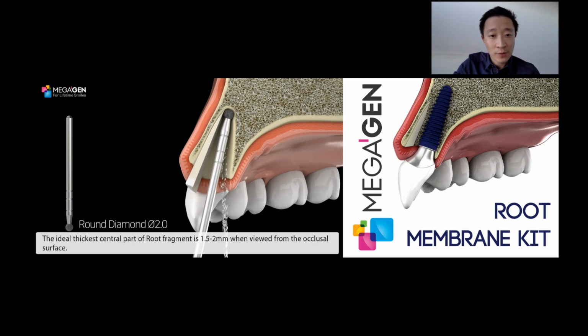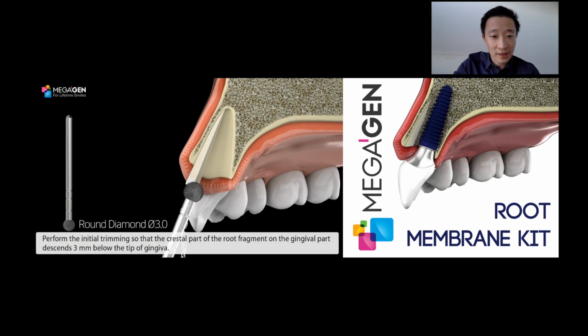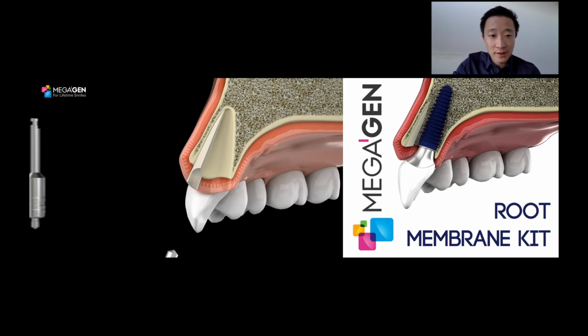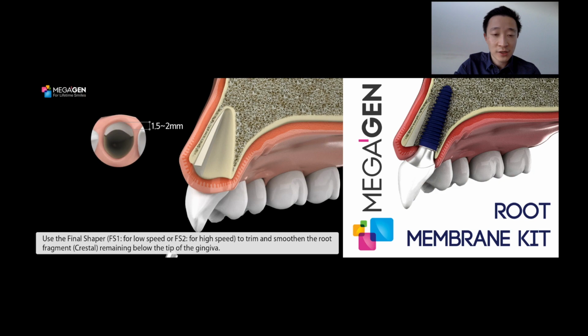With a couple of round burrs, you're going to reduce this down until it's about 1.5 millimeters thick, and then start reducing it in an apical direction so that it is level with the crest of the bone on the buccal. This next burr, the final shaper 1, only cuts on the end, and as you can see, it protects the gingiva as you are trimming down that last bit of the shield.